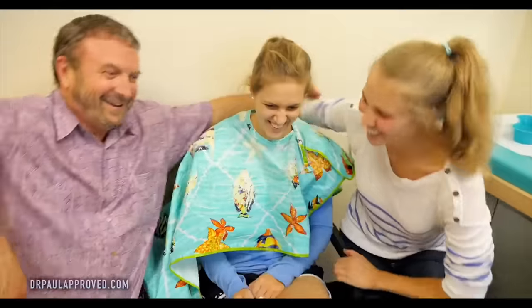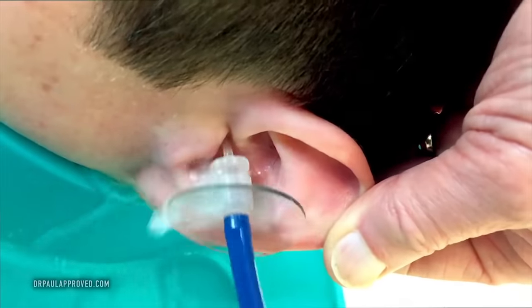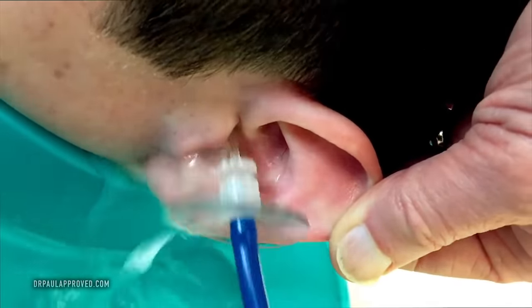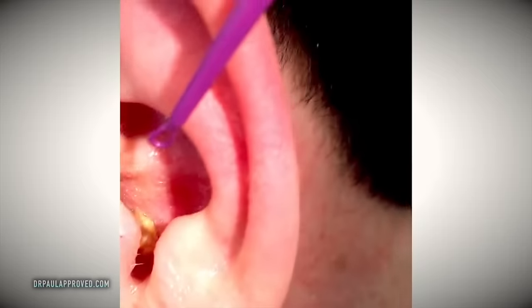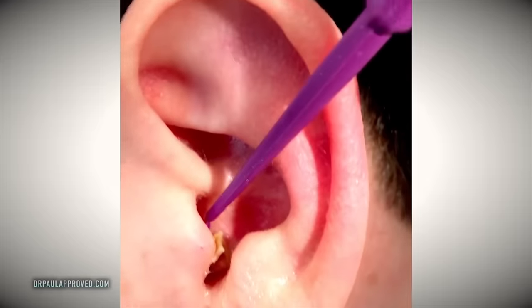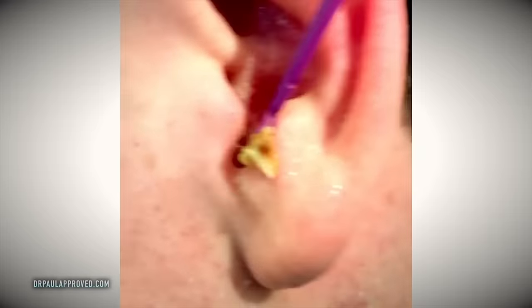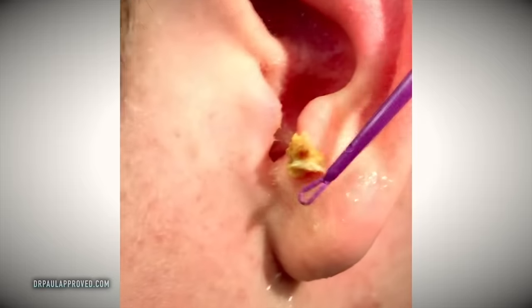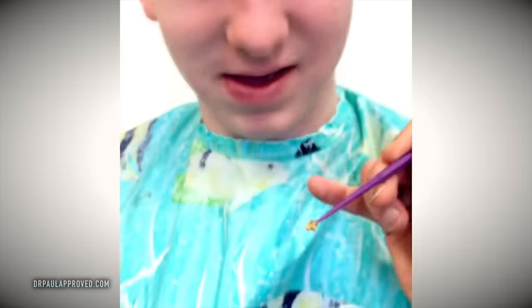If you want to get the other one out — all right. We survived. Gets behind the wax and starts to push it out. There we go. So we're seeing this chunk right here of wax. Look at that baby. I'm going to try to catch it for you so I can show you. Oh, look at that baby.